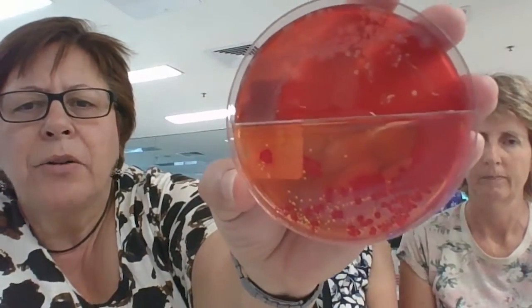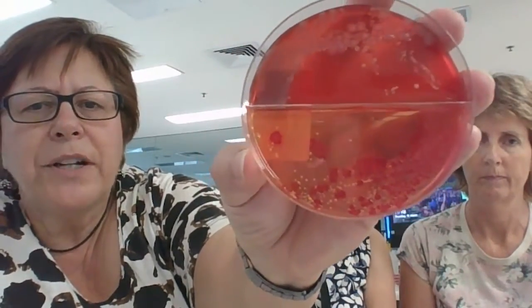Yeah. So here we have staph. There's a mixture on here, staph and E. coli growing on this plate. So one of the things that we wanted to mention to you is that you're also a microbiologist when you're very careful about which colony you touch, because it's really important that we set up susceptibility testing.